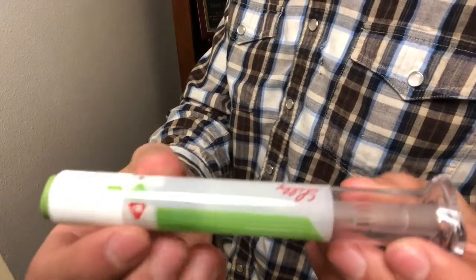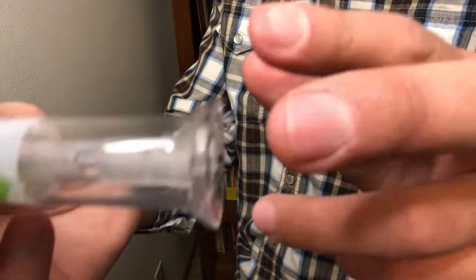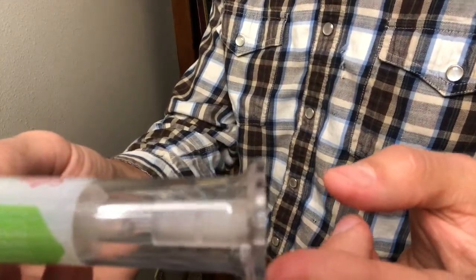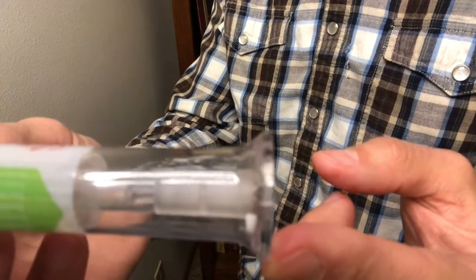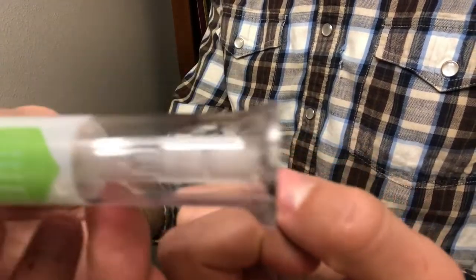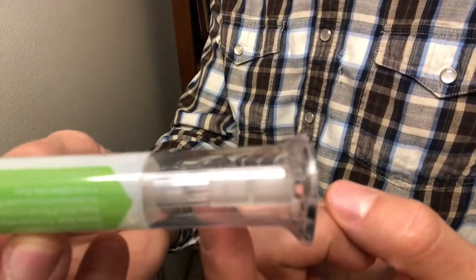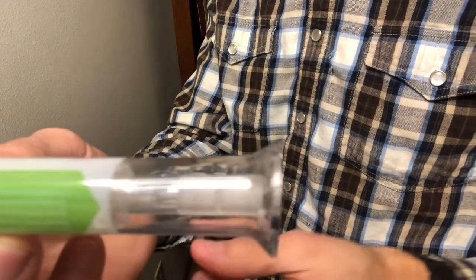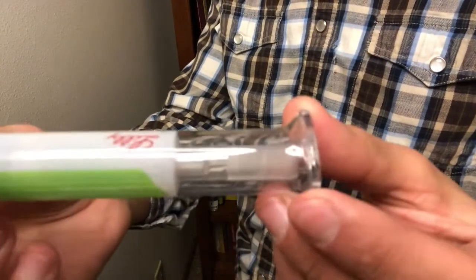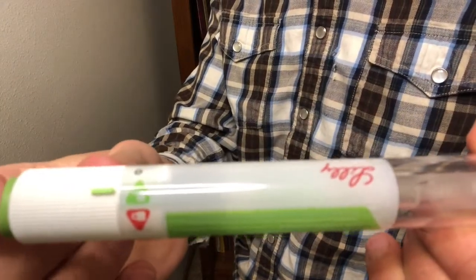I also want to let you know that when you're looking at this part, the medication should be clear. It shouldn't be cloudy or turbulent. So you always want to be checking there. And there shouldn't be any objects there. Once we inject the medication, a gray part will come here. So I'll show you that once we inject it. So just remember to check that. Again, I just turned it to unlock. So it's ready. If I push this now, the injection will go.